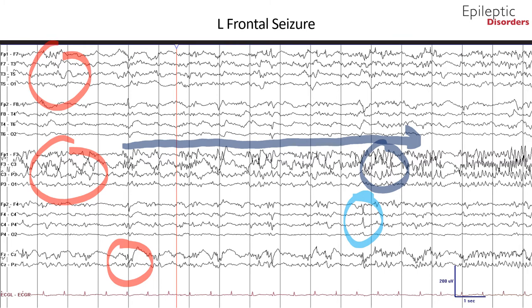In the last two seconds of the page, the seizure takes off with sharp wave activity increasing from the theta range to alpha range, eight to nine cycles per second. The morphology of the sharp waves also evolves, with initially poorly formed complexes early in the epoch and later well-formed sharp waves. Note the field with spread to the frontal midline channels as well.